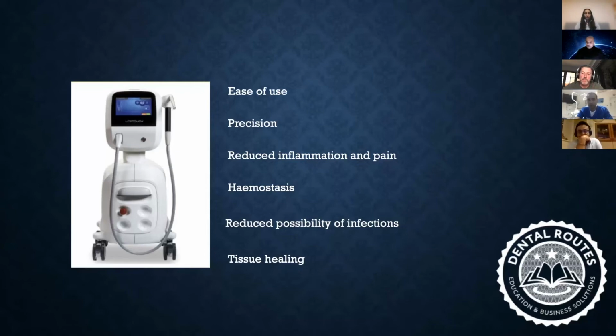Koushik again brought this up in how it is used in periodontal problems or in peri-implantitis. In my practice, early stage peri-implantitis is now treated exclusively with lasers, predictably and with minimal discomfort to my patients, with almost no explantations since I have started using lasers.